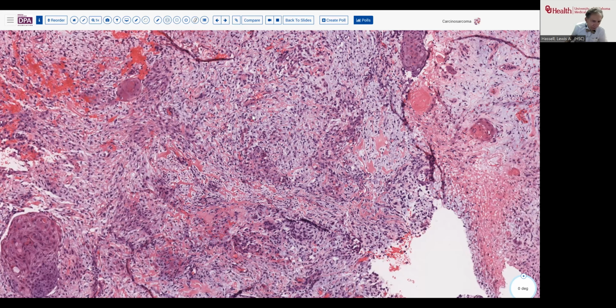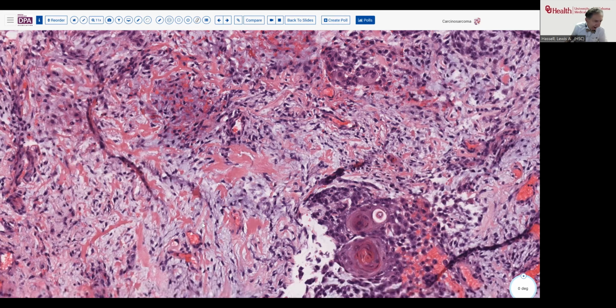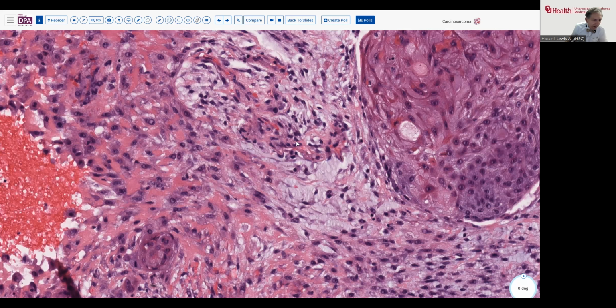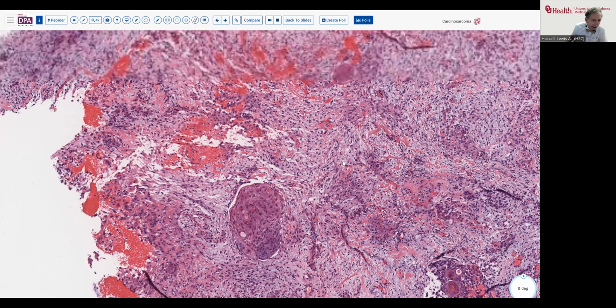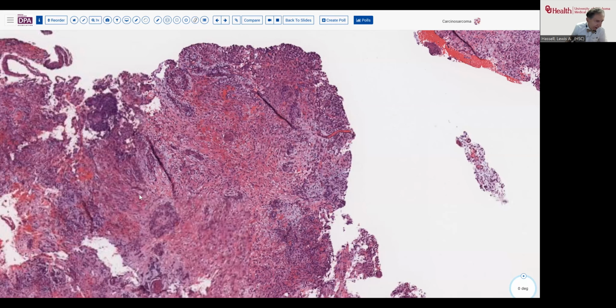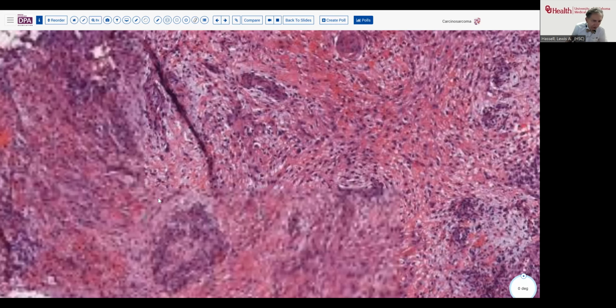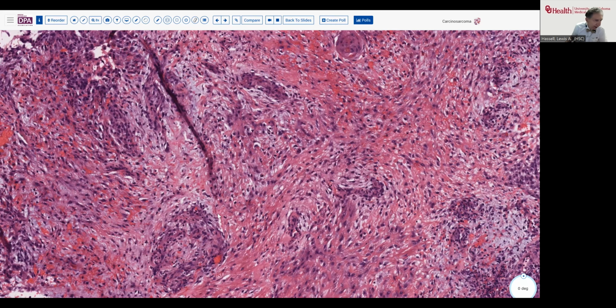A little bit sarcomatoid appearance, maybe poorly differentiated glandular tissue, another keratin pearl down here, some hyalinized collagen in areas here, and then this loose interstitial pattern of stromal cells, which have some atypia, have mitoses, so this we interpreted as being an area of recurrence with divergent differentiation following the therapy. Endometrial carcinoma with squamous metaplasia and a sarcomatoid transformation of the tumor, giving this nice stromal pattern, streaming cells, variable degrees of atypia associated here.